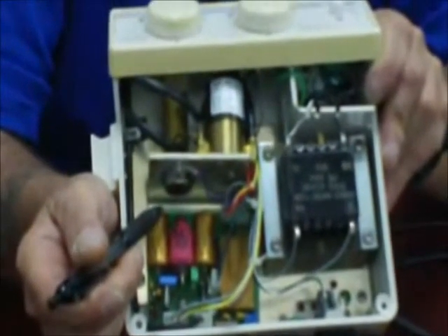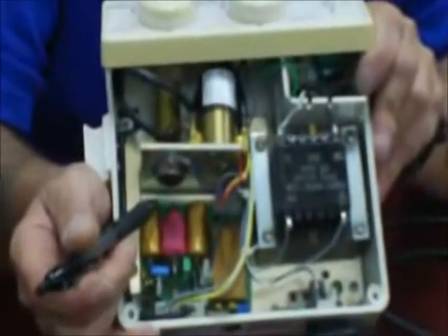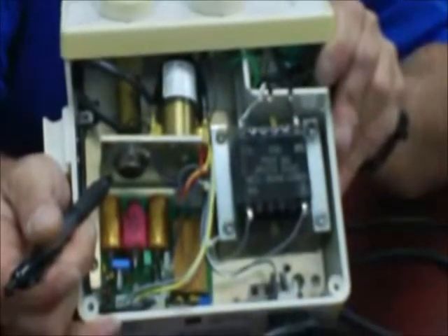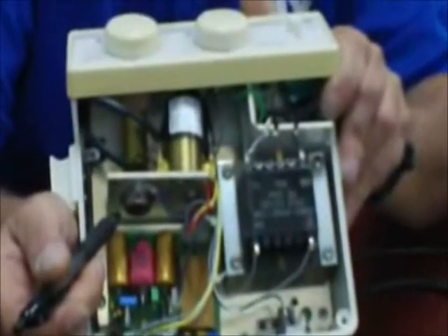Board-level repairs cannot be done in the office — only outright board replacement. When you have or suspect a board problem, immediately forward the entire machine to SER. Don't take the board out. Let them scope the board and replace components if the board is repairable. Unless you have an oscilloscope and know electronics, do not fool with the board.